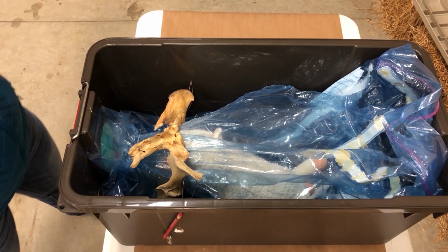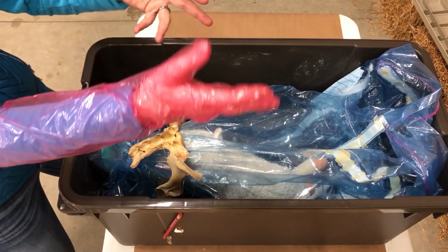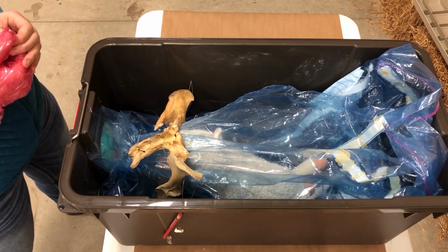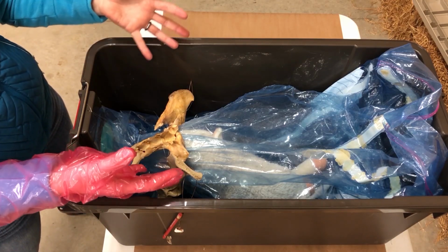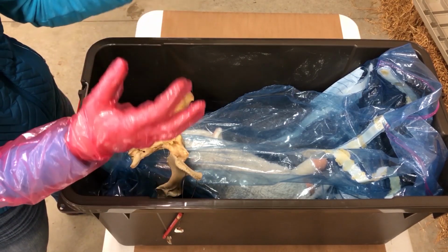So this is all well and good when I tell you that you should just push that animal back in, or flip it around, or just push that back, flip this leg up. It seems easy, right? It's much easier said than done. This whole time the ewe is straining against you. She's having contractions. There's a lot of back pressure just from her body and her fluid.